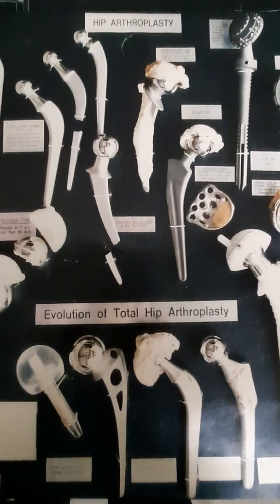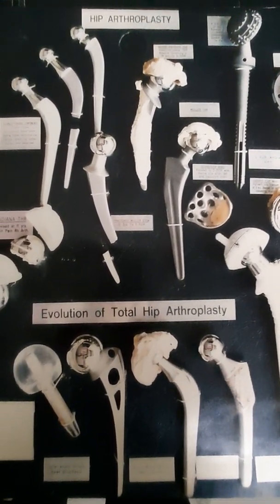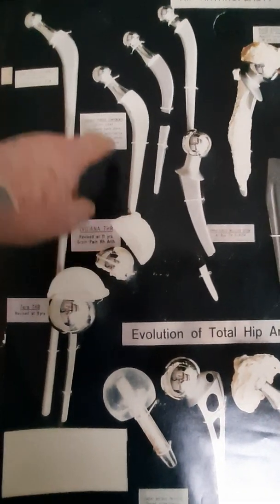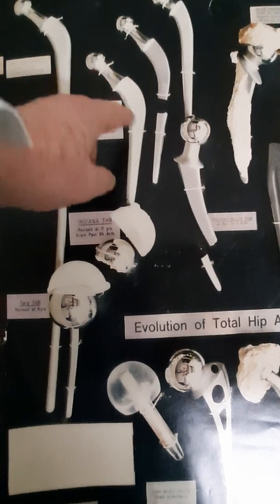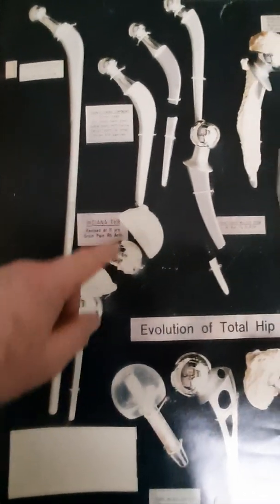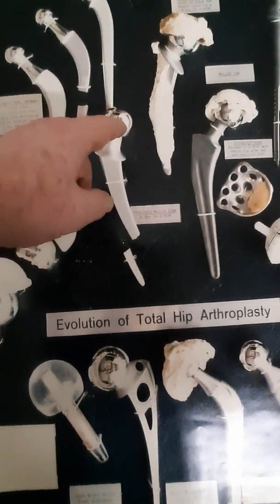Hip arthroplasty. The story of hip arthroplasty or hip replacement starts certainly in the English-speaking world with Sir John Charnley. And here he is with a stem, 22mm head, banana-shaped stem. Here's a longer one for revision situations. Here's one that's actually broken. It's quite unusual. A contemporary of his was a German, Muller.